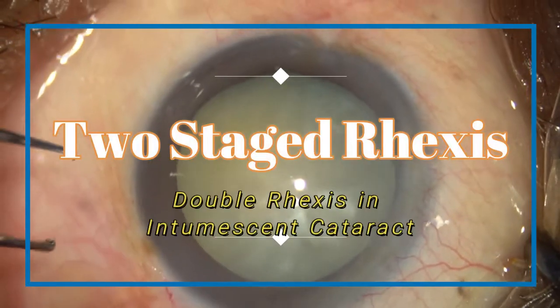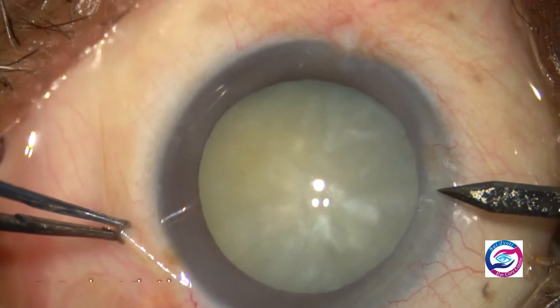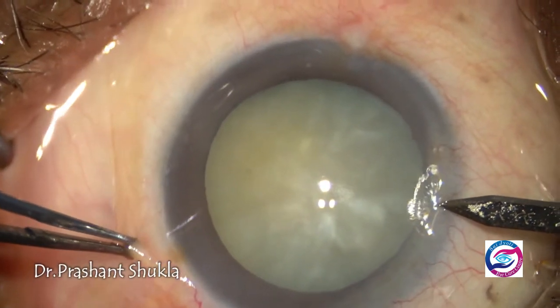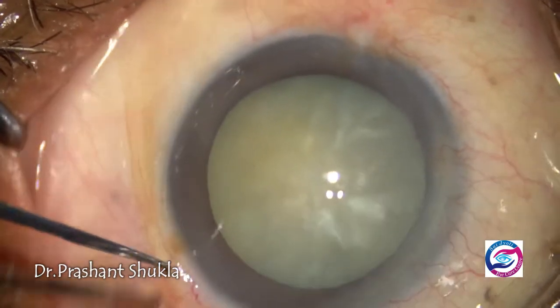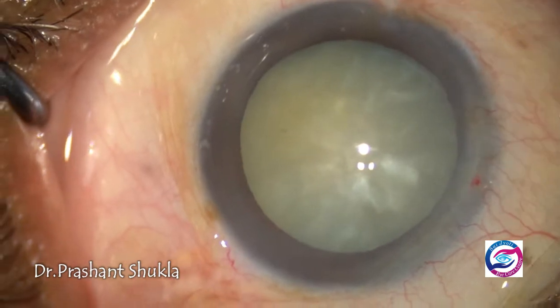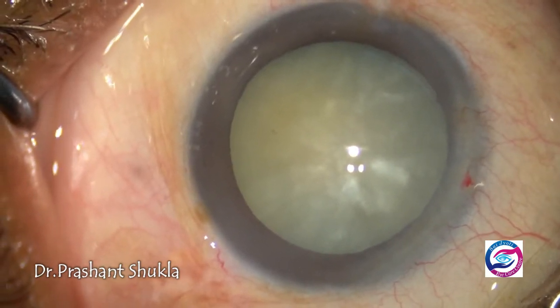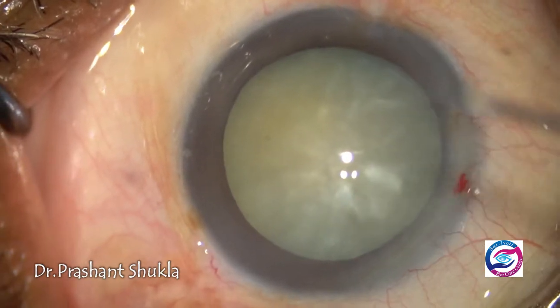Hello and welcome. Today I shall be demonstrating the two-staged Rhexis technique for intumescent cataracts. Intumescent cataracts have a high intralenticular pressure, and because of that there is always a chance of Rhexis run out.